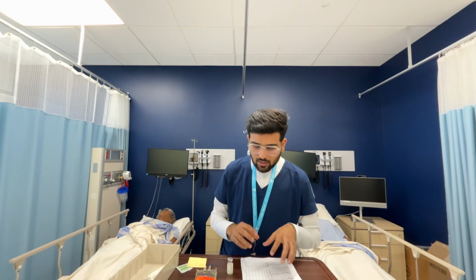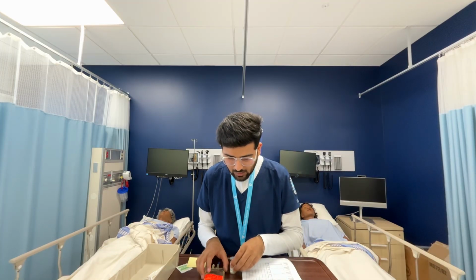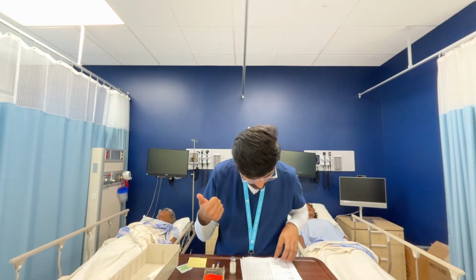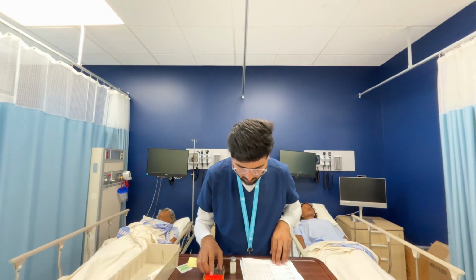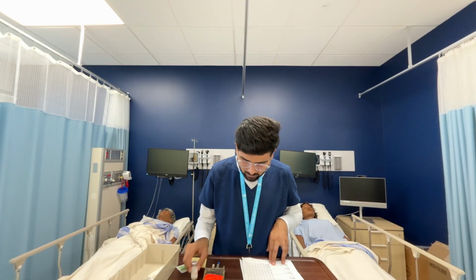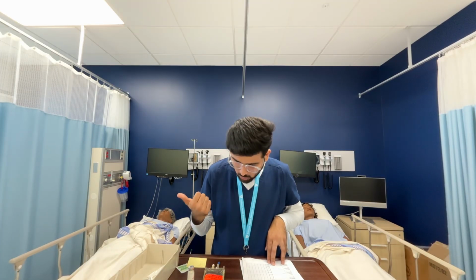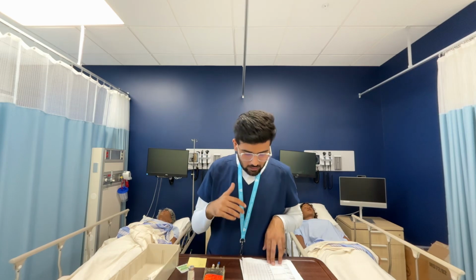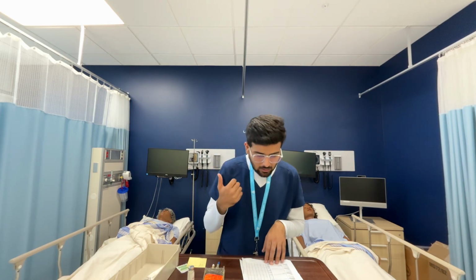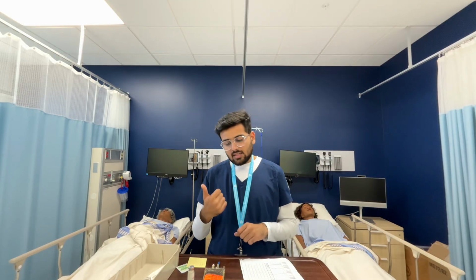Now I'm gonna perform my third check. For third check, I'm gonna do the Fiona Sherrick, right patient, pantoprazole. I'm giving the right medication. I'm giving 80 mg, 2 ml of medication, right dose. I'm giving through IV. So right route. I'm giving twice a day, right frequency, and I'm giving at 1000 hours, right time.